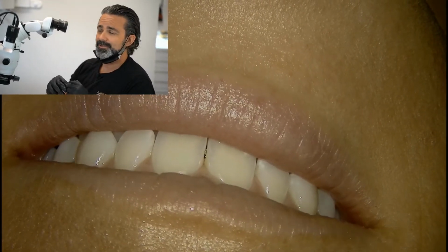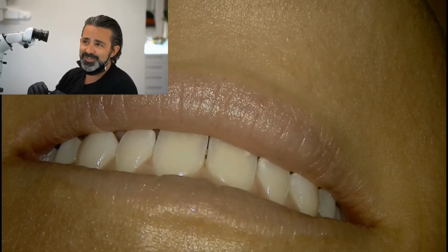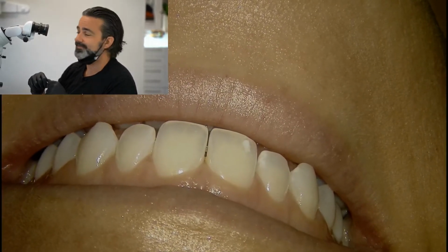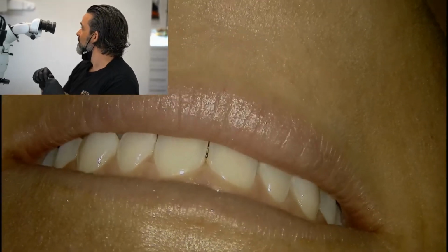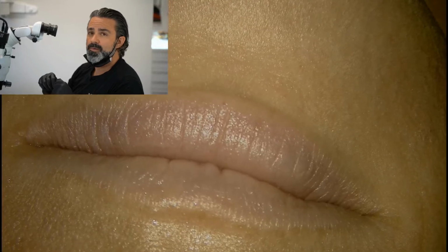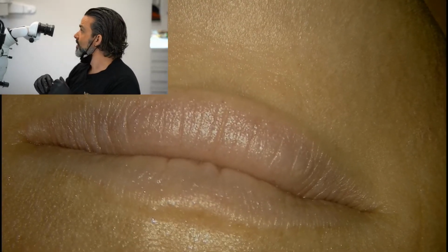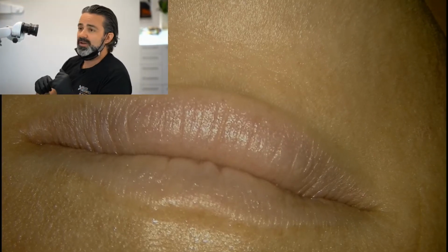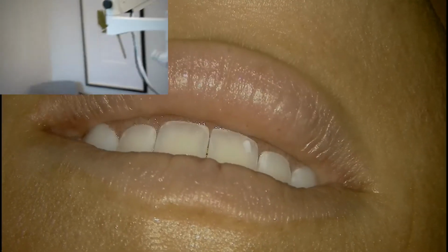Okay. Lucas, give me another question. Do you want to go through maybe all the pieces and just explain how they can be tailored to any room, any configuration? So with this company, Siler, they have something called a high mount and a low mount.